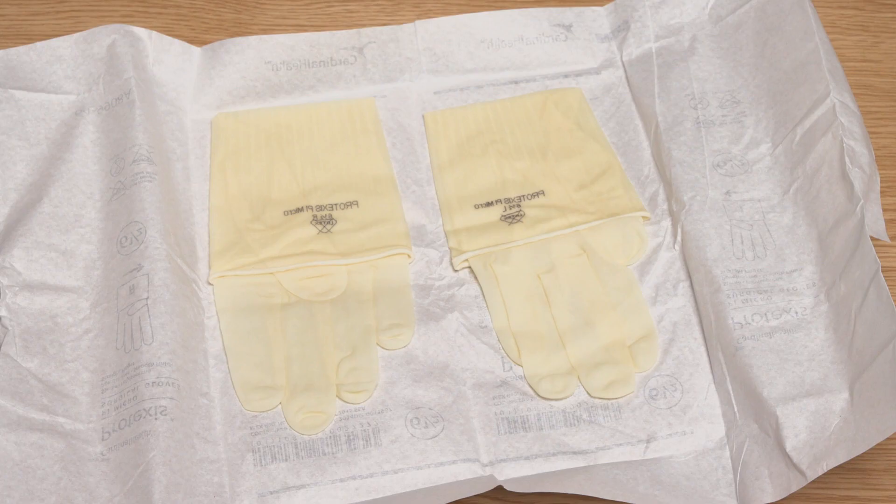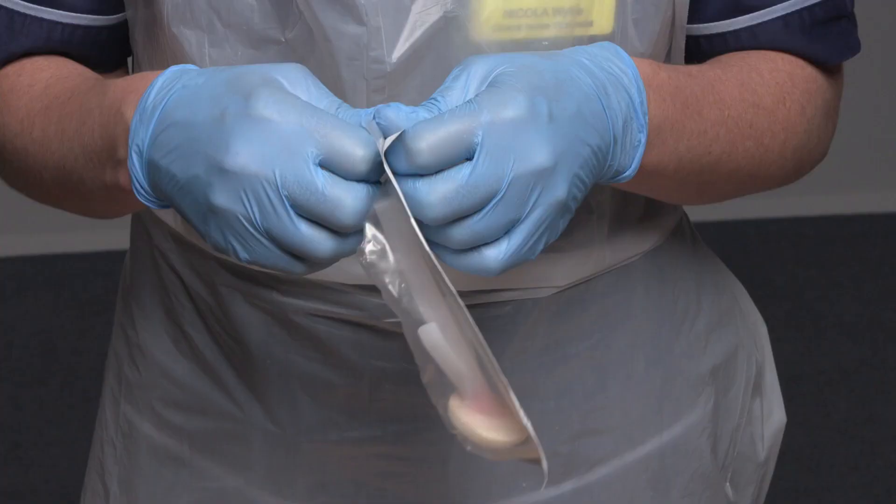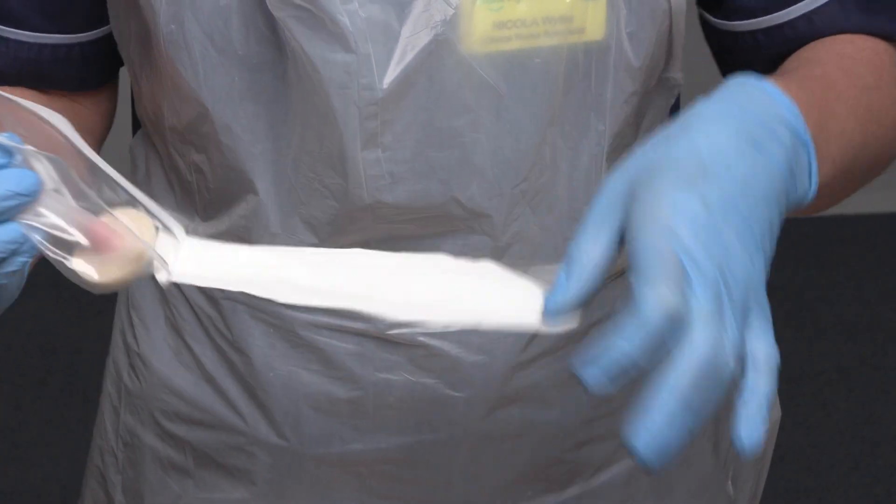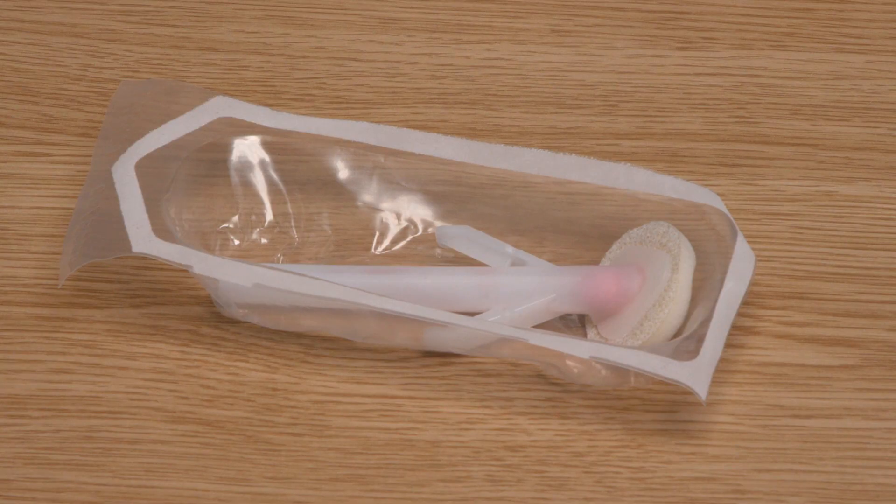I also need a pair of appropriately sized sterile gloves. I will peel open the packet of the second wand but instead of placing this onto the critical aseptic field I will place it to the side. The wand packaging is now a microcritical aseptic field, maintaining asepsis of the wand until I am ready to use it.